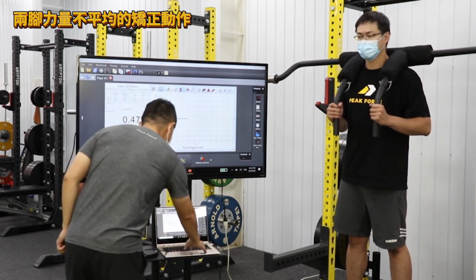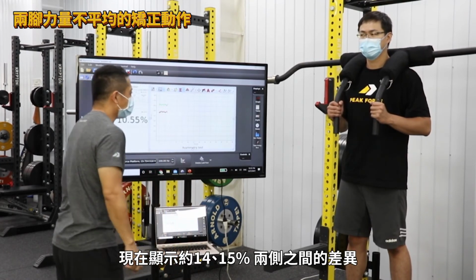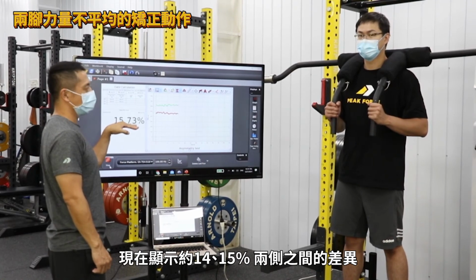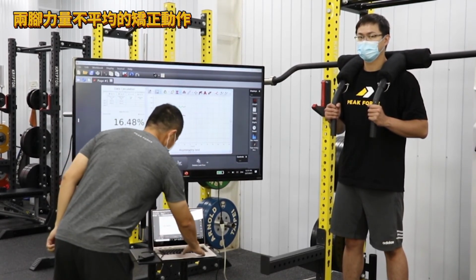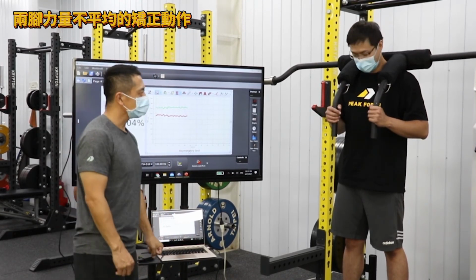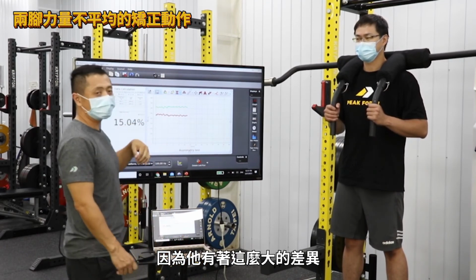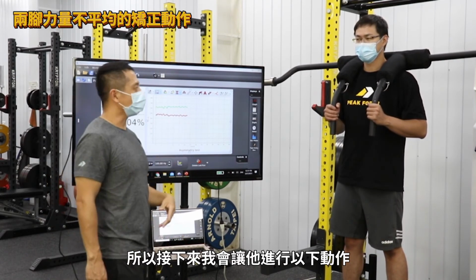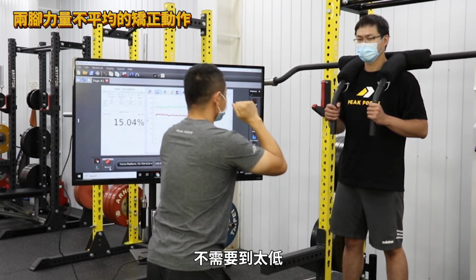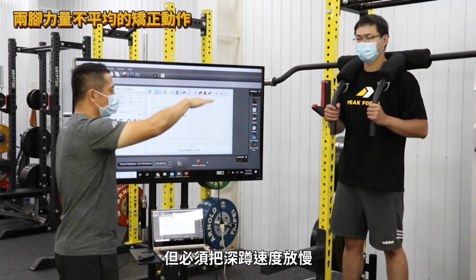So let's do the trial first. So I'll let you stay there, and then hit the record. So right now I have right around 14-15% difference between the two. 好，那现在我是静态站姿，那就得到一个数据，就差不多15%这样子，就不太妙了。So because of this wide difference, what I'm gonna let him do the second one is a slow squat. You don't have to go deep, but you're gonna go a little bit slow motion of the squat.